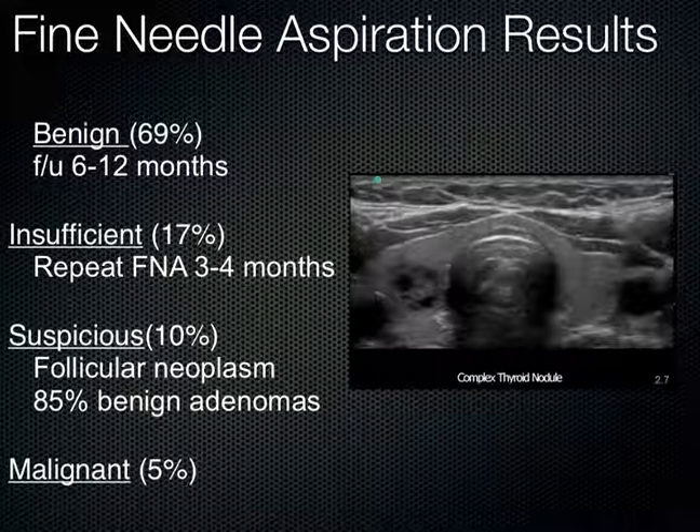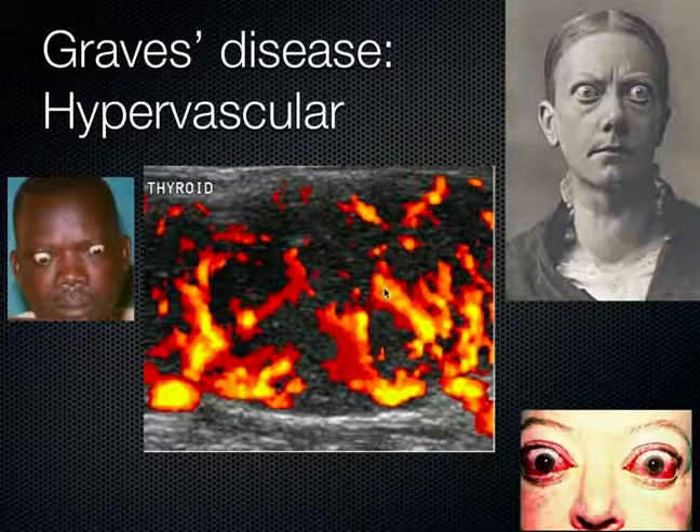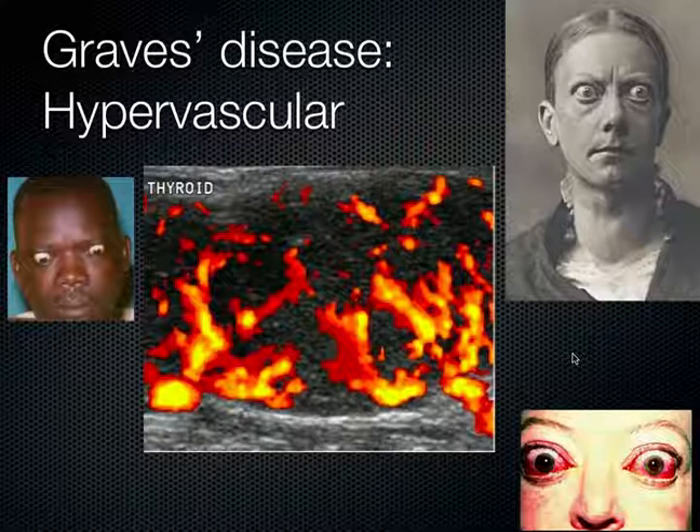Another thing that comes up a lot with the thyroid is Graves' disease. You can see a really hypervascular thyroid in the setting of Graves' disease, and many times the patient has prominent ocular proptosis. We see a large goiter in the neck — this whole autoimmune situation going on — with very hypervascular thyroid nodules, which is very consistent with Graves' disease. Just a generally enlarged and hypervascular, revved-up thyroid gland.